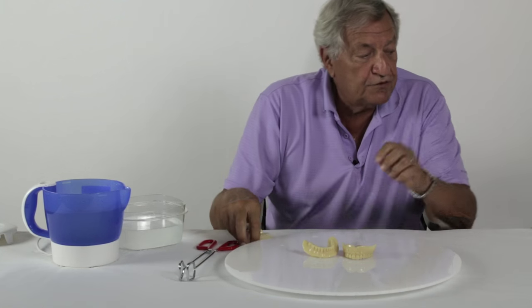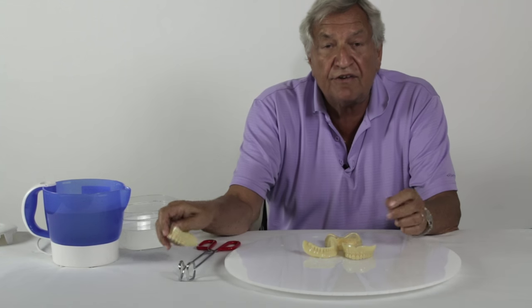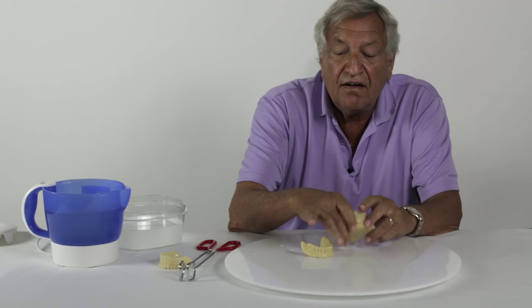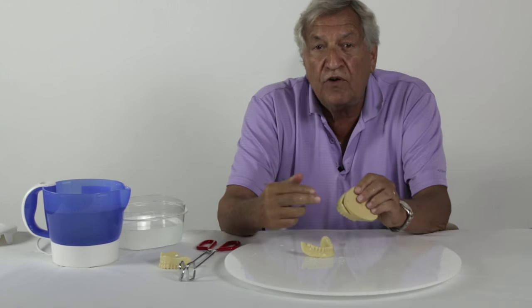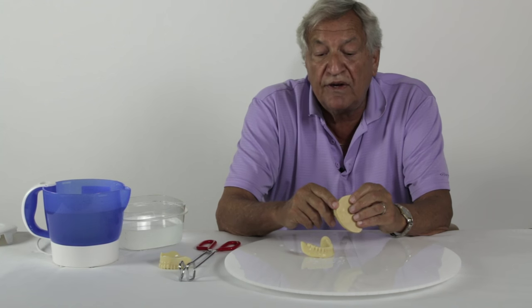So the first part of the clinical procedure is to heat the trays, put them in the water as shown, and make a custom tray. When they're warm, you can trim them with a scissor. Or when they're cooled, you can trim them with a burr.